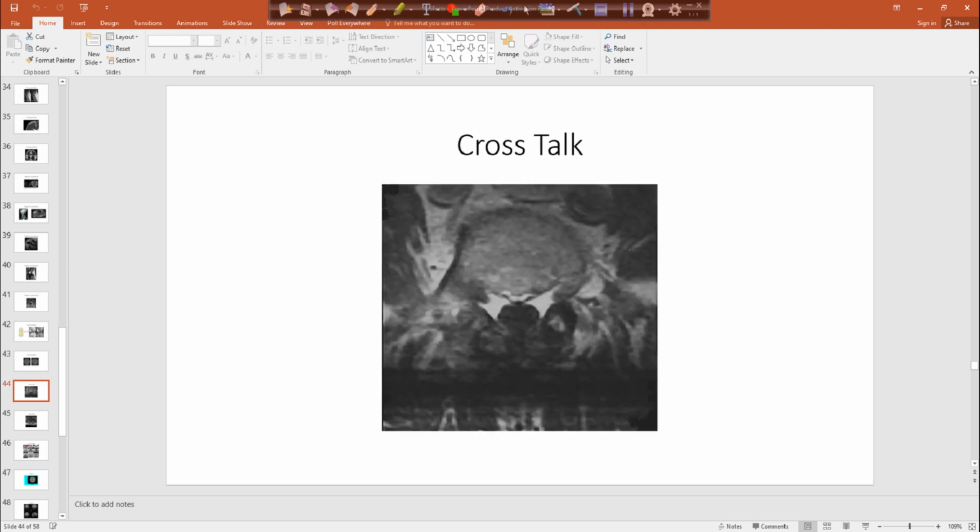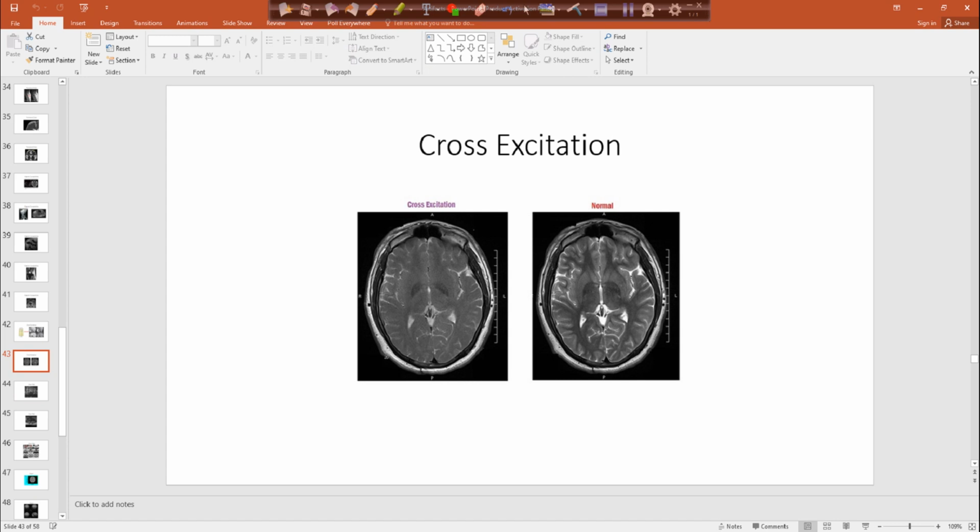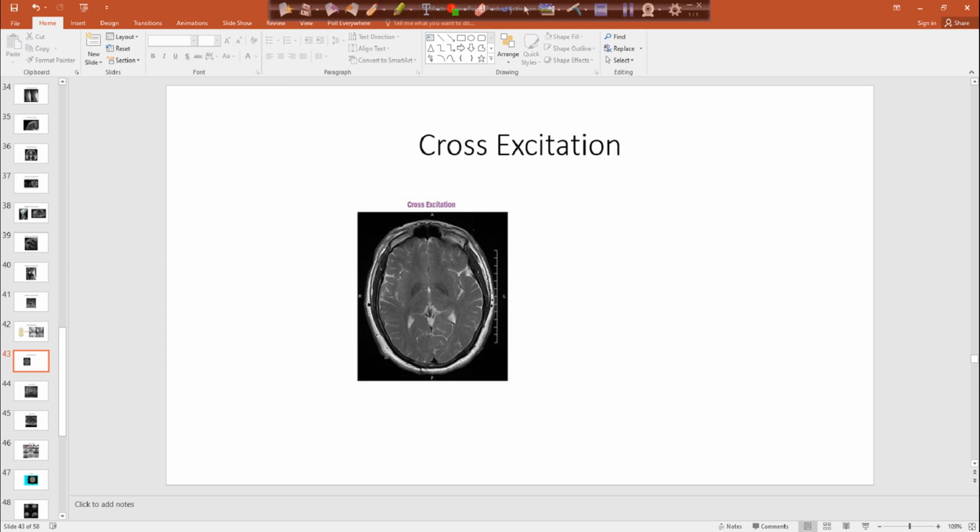So this only happened in one slice over time, or? No, I'm saying you can only visualize it as you flip through your slices. Okay. So see how, Lily, if you just had this image right here, you can't see anything, right?